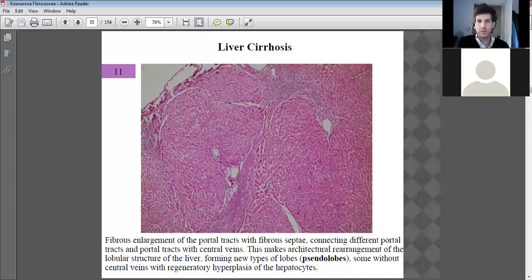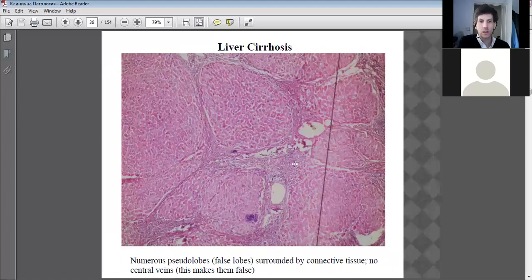We probably have to look at a high magnification to see more of the hyperplasia and atrophy. Okay. Do you have any questions? No, I'm okay there. Good.